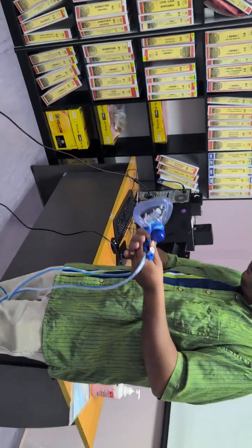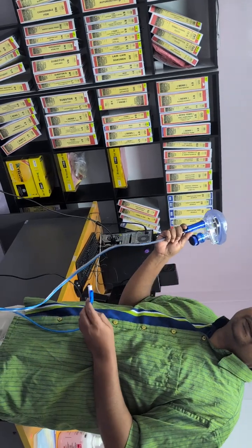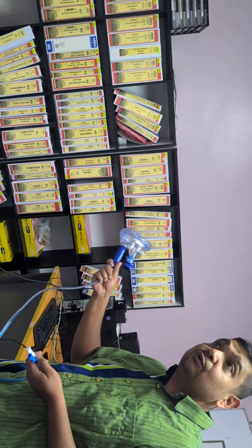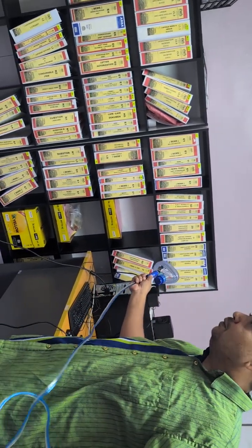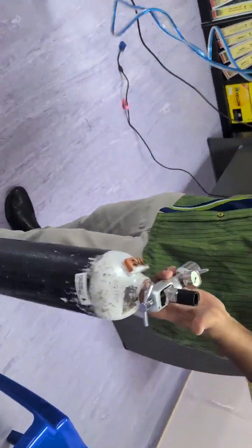Without mentioning names, I have been telling the ICUs: when you want to send the patient down, you might as well know what PEEP you're going to give and what FiO2 you're going to give. Just put it on the patient, send him down, and pass it on to the ward. I'm going to show you guys. You need to take the camera.